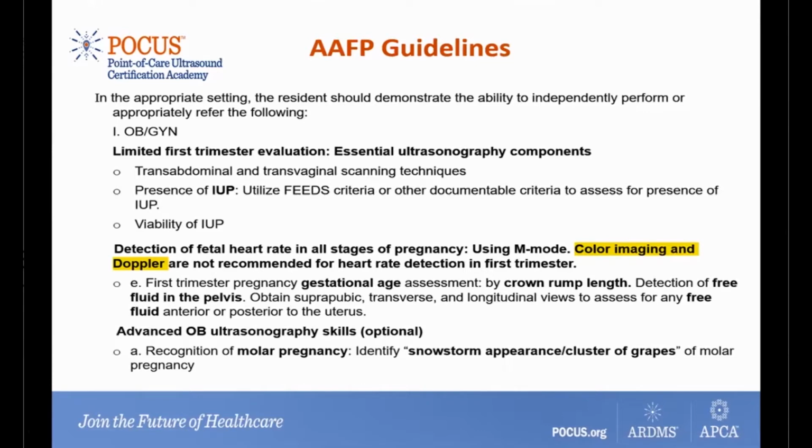If you remember, organogenesis is happening during the first trimester, and even though there is no documented evidence of injury to the embryo or the fetus in the first trimester with diagnostic ultrasound levels, it is best to still follow the ALARA principle to create a much safer environment for the developing embryo.